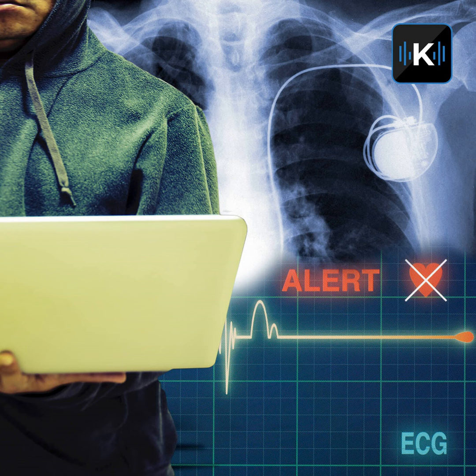Whoa. And all that I just said, that was just from one healthcare organization. They also found dozens of vulnerabilities in other medical devices. The security researchers devised what they called honeypots. These are basically fake machines that disguise themselves as the real deal, the real equipment, and they lure hackers into an attack. Get it, like bees and honey?